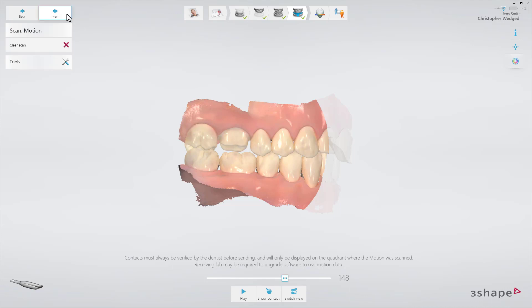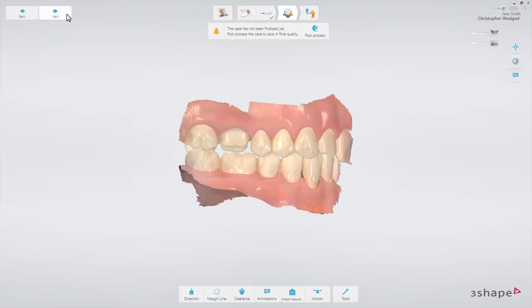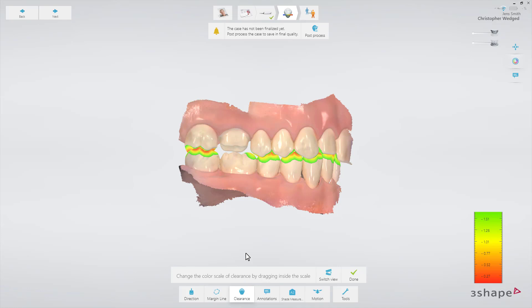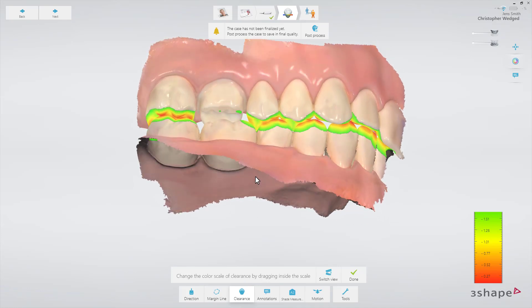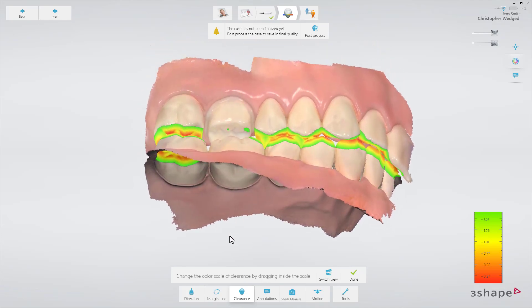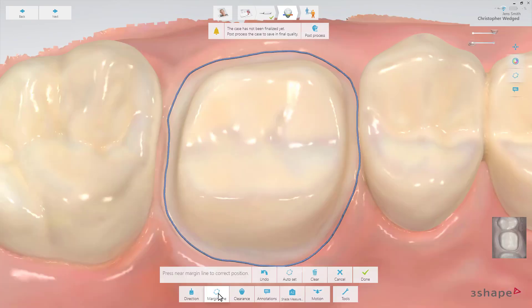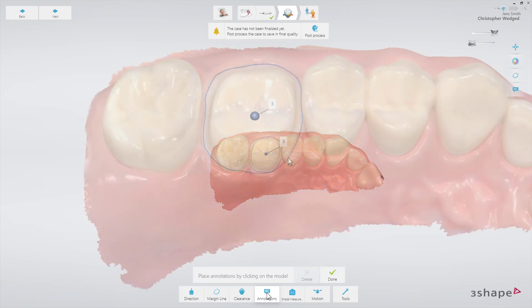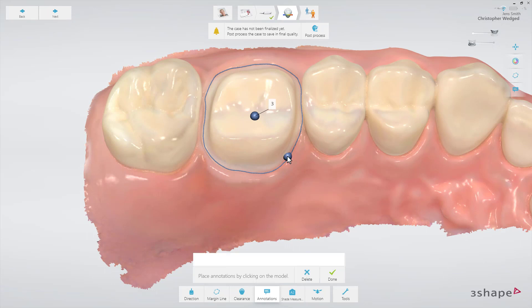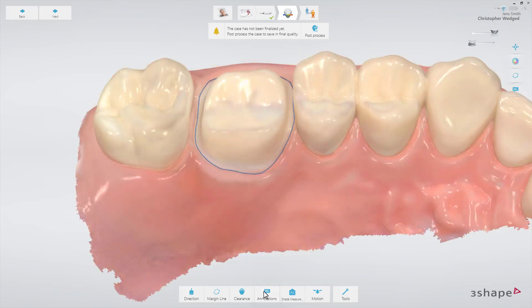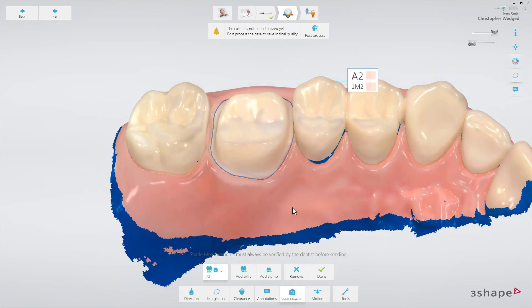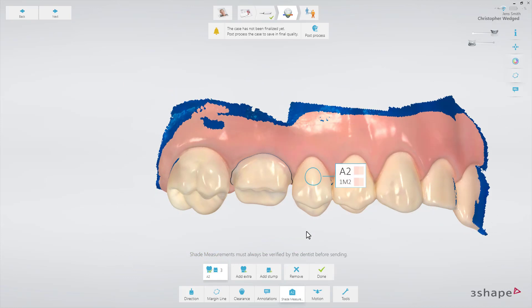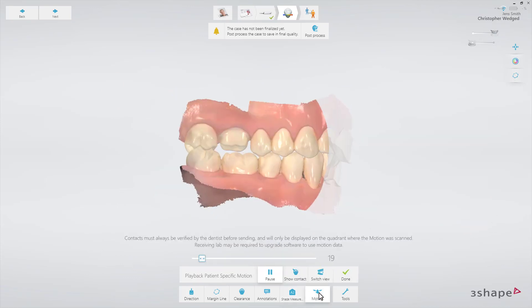Now go to the validation page and confirm that there is enough space for the reconstruction between the upper and lower jaw using the clearance tool. Optionally, you can set the margin line. You can also add some comments on the 3D scan using the annotation tool. Shade measurement is also available here, and dynamic occlusion can be examined here too.